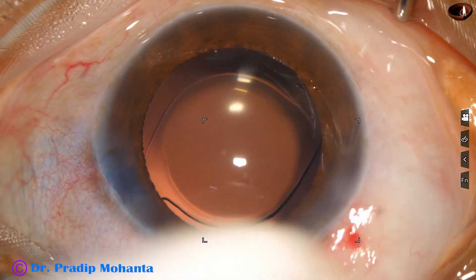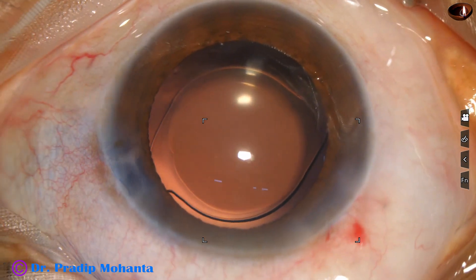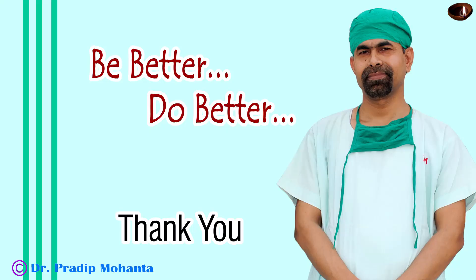The integrity of all the wounds is checked. Few drops of moxifloxacin is applied over the ocular surface and the case is concluded. Thank you very much for your attention. Hope this video will help you in developing your surgical skills. Be a great surgeon and serve your patients with love, respect, empathy, and great surgical competence.